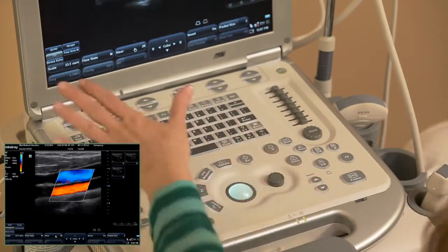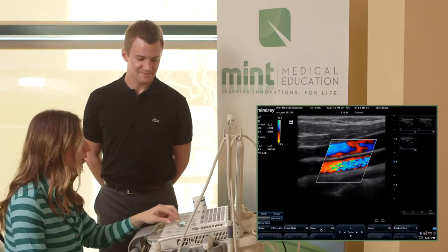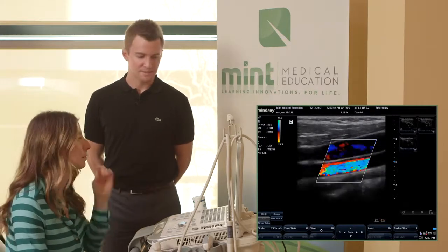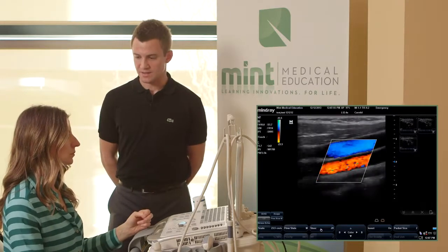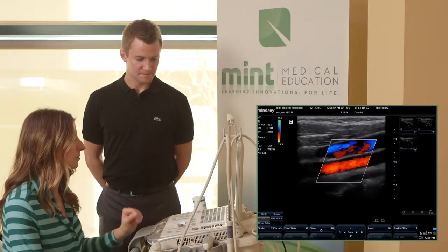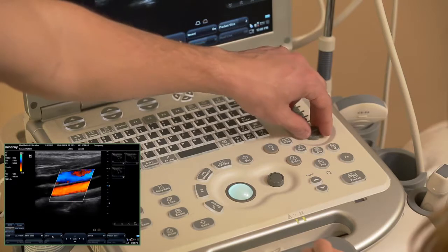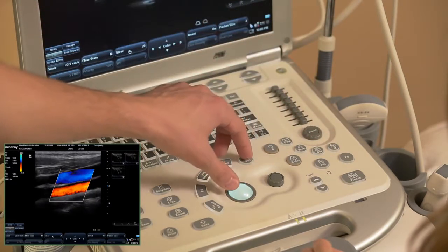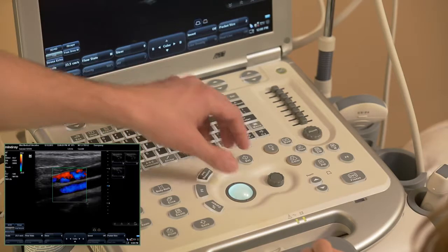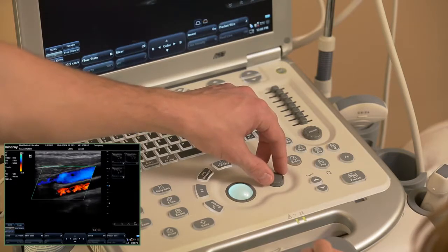So most of the soft keys are controlled by either the soft key or putting your cursor over and using the set, or using this rotary nav. Yeah. Most of them are, depending on what mode you're in, if you're in B mode or color mode or Doppler. Exactly. It allows users then to feel more comfortable in the choice that they make in order to control the settings. Yeah, because some people don't like going all the way up here to make their, I would think. Exactly. You'd rather keep your stuff right here. Yep. And so we've controlled the gain a little bit, and we also want to talk about the box size which you've changed, because it is important to optimize that box size. And so if we get our cursor away, which you've seen me touch the cursor button a couple times, now when I'm hitting the set key, allows me to make that bigger to fill the vessel, and then adjust my angle and steering as well.